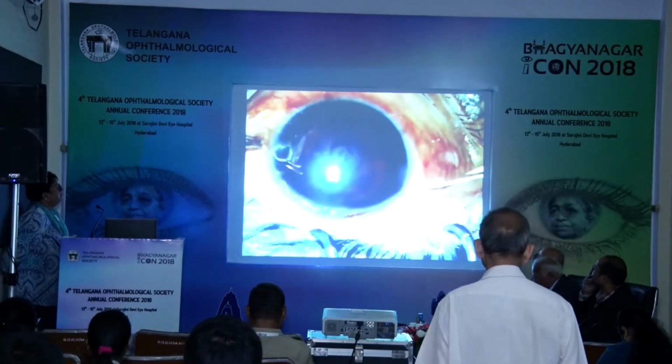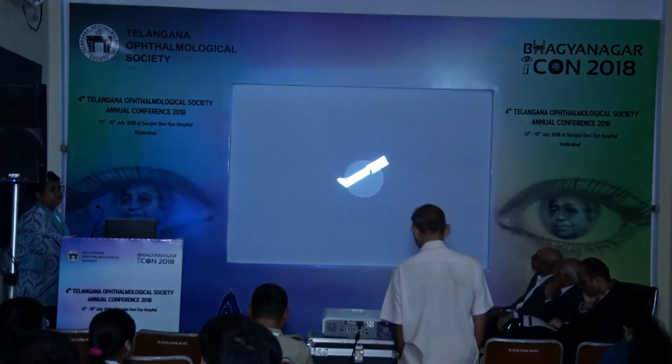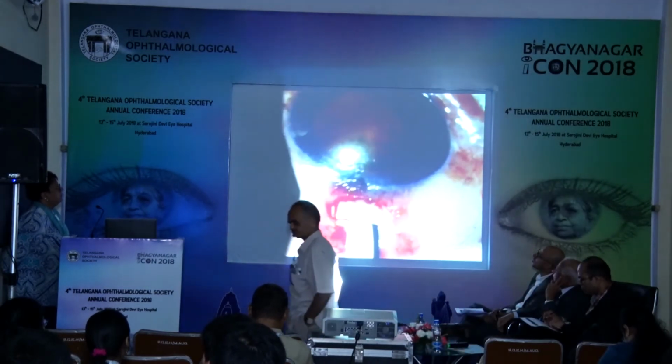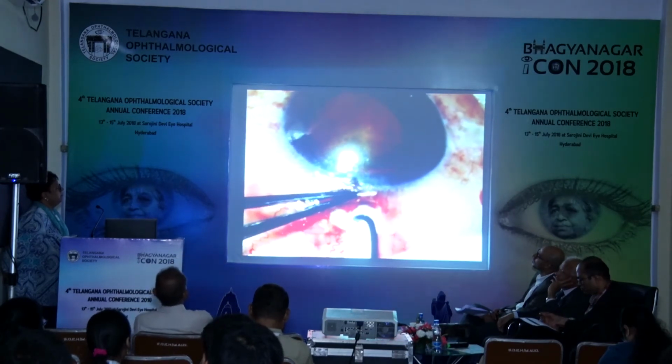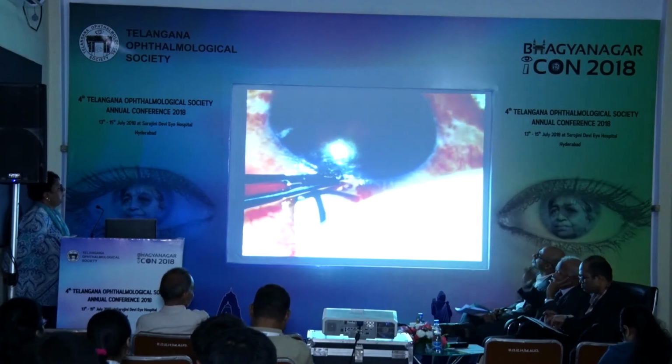This conjunctiva-sparing, minimally invasive technique for trabeculotomy with the Kahook Dual Blade can be used as an alternative to bleb-forming surgery. However, trabeculectomy can still be performed should it be required in future.